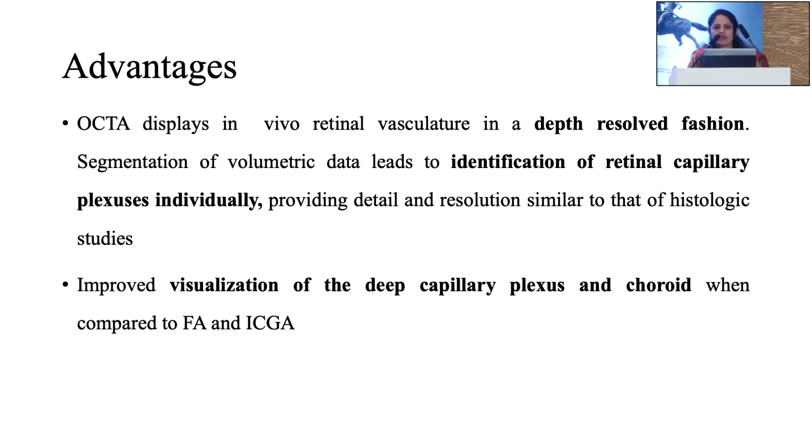So why OCTA? Till now, our mainstay of retinal vascular imaging has been fundus fluorescein angiography and ICGA. OCTA is non-invasive. It is not using any dye. So the risk posed to the patient because of the use of dye, which can be from a mild allergic reaction to anaphylaxis, we do not encounter with OCTA.